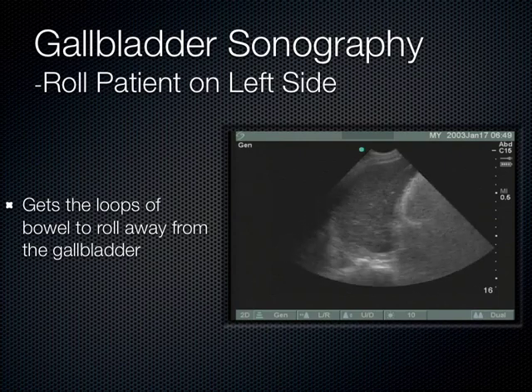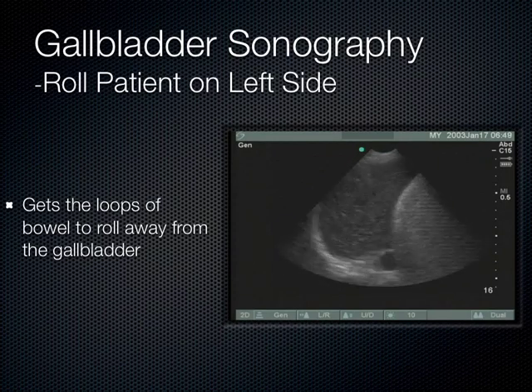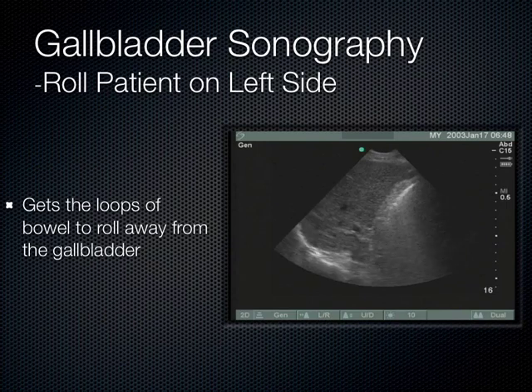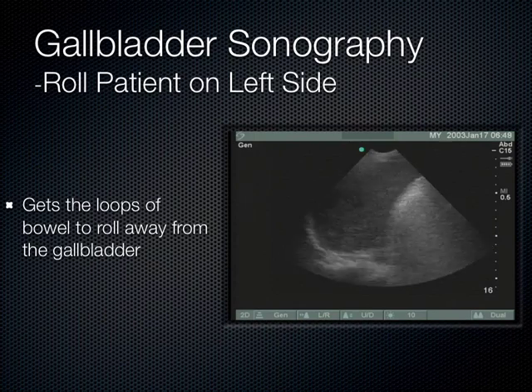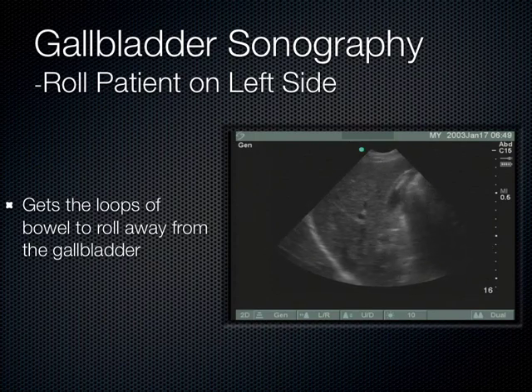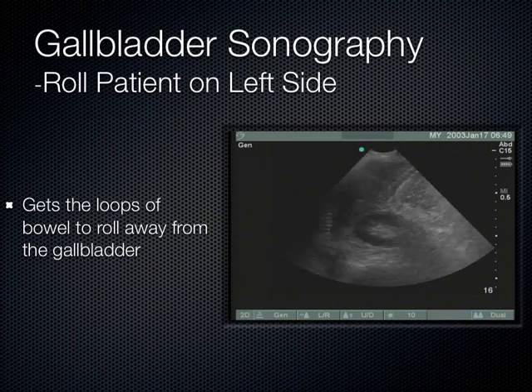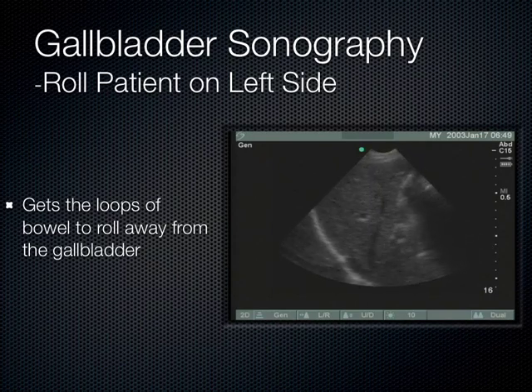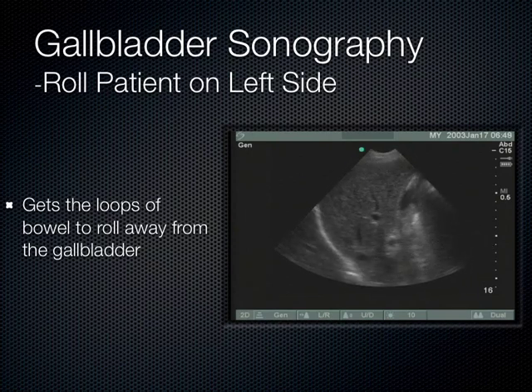There's this one plate on Netter where you take that hook or whatever, and he like pulls the liver back, okay, and you can see the gallbladder sitting up here in the fossa, and then you look down, like if you let go of the hook, the whole thing would crash down on what? Good, second portion of the duodenum. So that's where the air is in that duodenum getting in your way, okay? That's always going to be the problem with the gallbladder. The air in the duodenum fouls up your gallbladder image, okay?